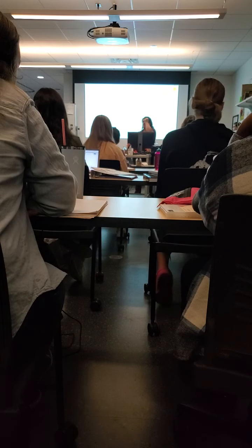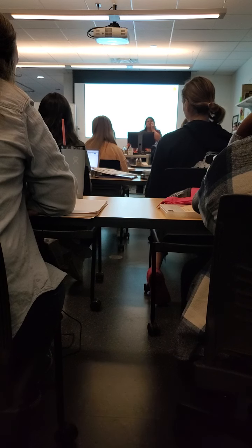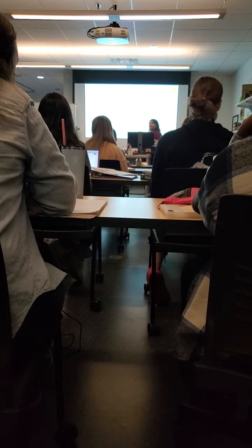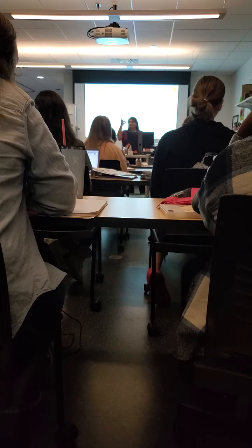About measuring the size, is it just intima to intima or adventitia to adventitia? You're going to go outside. Vessels are always going to be the outside. That echogenic part is where we measure. And so you're going to measure outer to outer. Outer to outer. Yeah. And don't worry about that. That's another class, you guys. Don't let it get you confused.